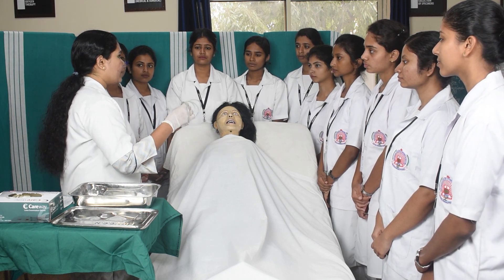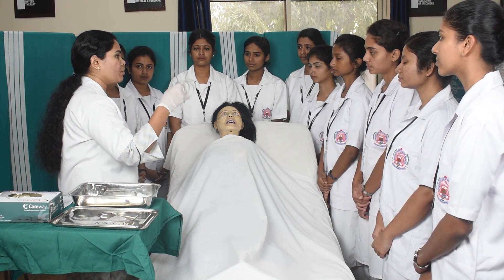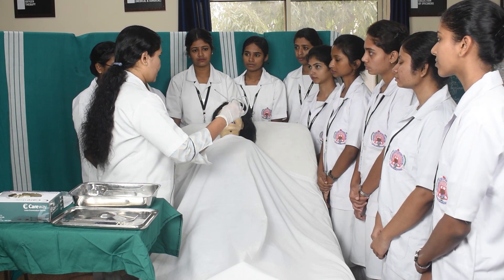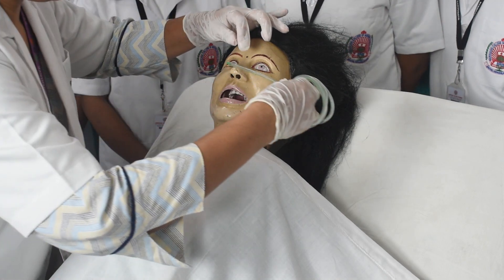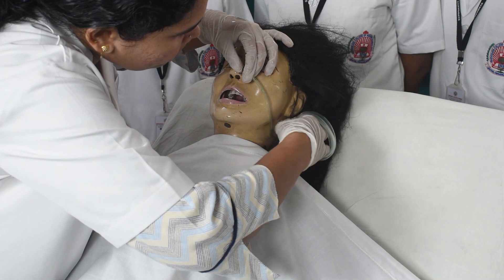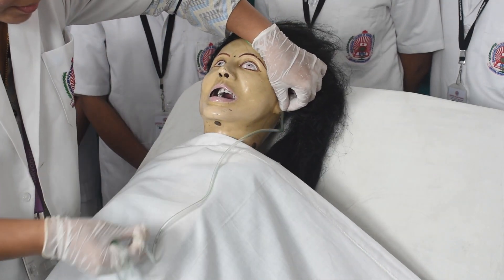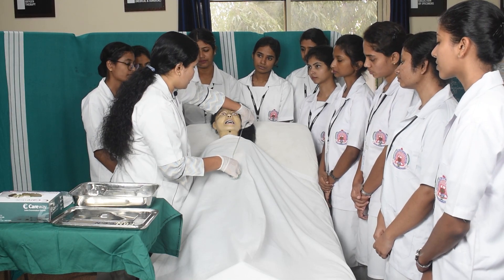After explaining, we have to take the measurement. Hold the ryle's tube in your right hand by coiling the tube. First, measure from the tip of the nose to the ear lobe. Then from the ear lobe to 5 centimeters below the xiphisternum — that is our total measurement.